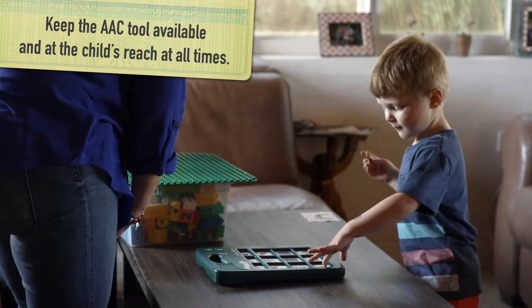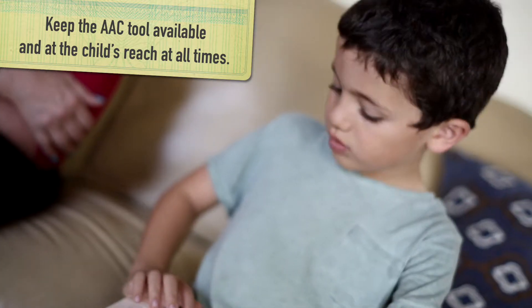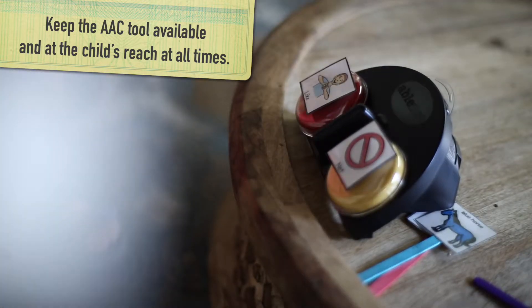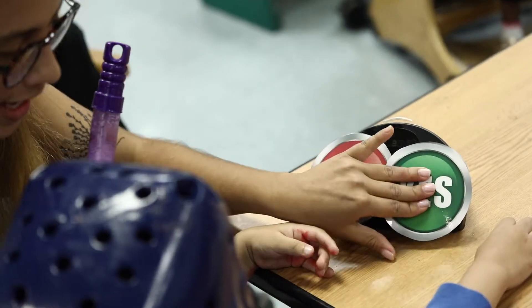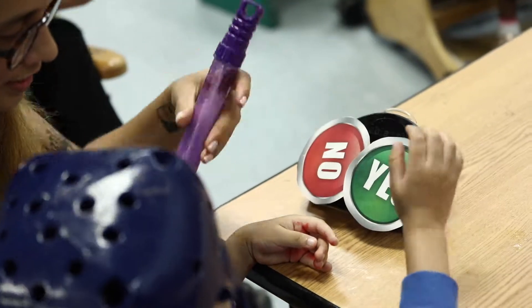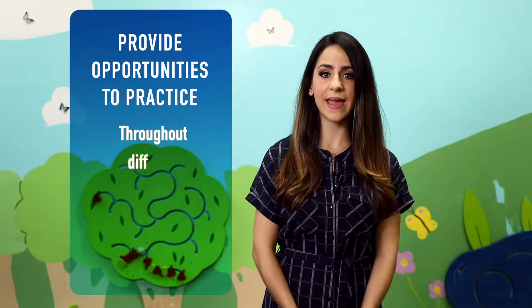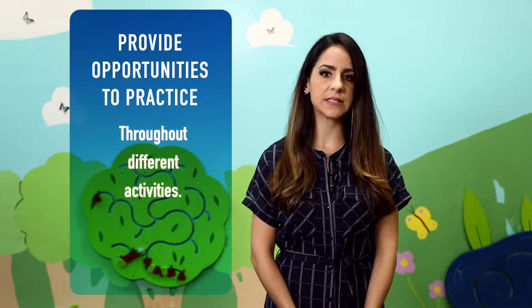Keep the AAC tool available and at the child's reach at all times. Remember, that's meant to be his or her voice. Continually provide opportunities to practice using the AAC tool throughout different activities.